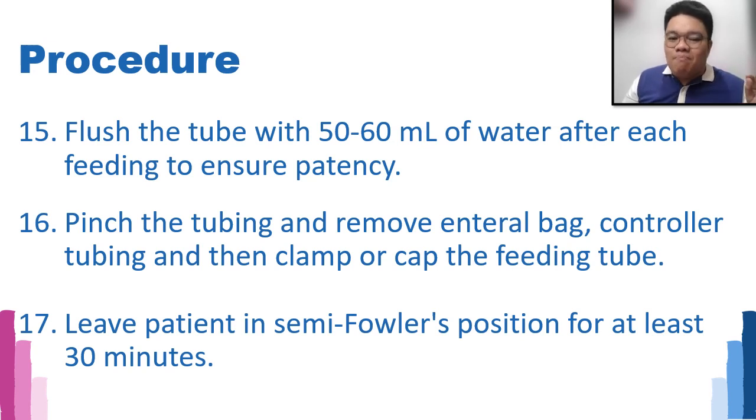Then we pinch the tubing and remove the enteral bag, the controller tubing, and then clamp or cap the feeding tube. Okay, class, before you clamp again, you need to pinch the tubing. Then, you need to leave the patient in semi-Fowler's position for 30 minutes. What's the purpose of this position, class? To allow for the food product inside the stomach of your patient to go down to the intestines and to facilitate nutrition and absorption.